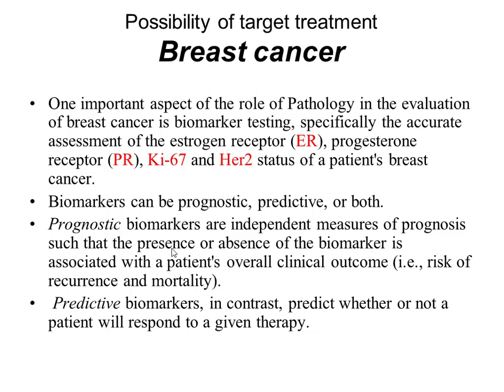Now I want to show you the possibility of the targeted treatment, which is mostly used for breast cancer. One important aspect of the role of pathology in the evaluation of breast cancer is biomarker testing, specifically the accurate assessment of the estrogen receptor, progesterone receptor, Ki67, and HER2 status of the patient with breast cancer. Biomarkers can be prognostic, predictive, and both.